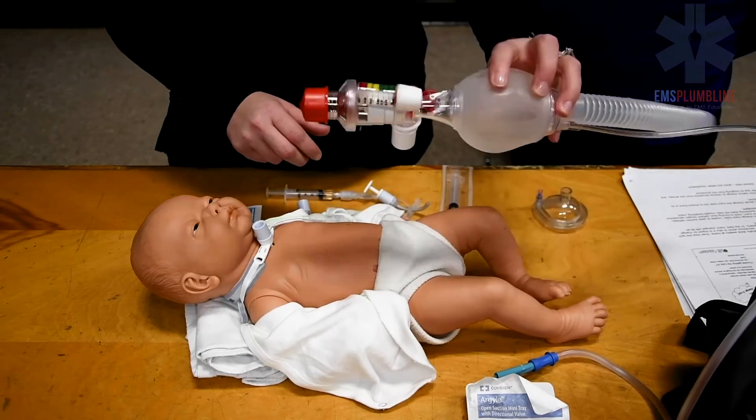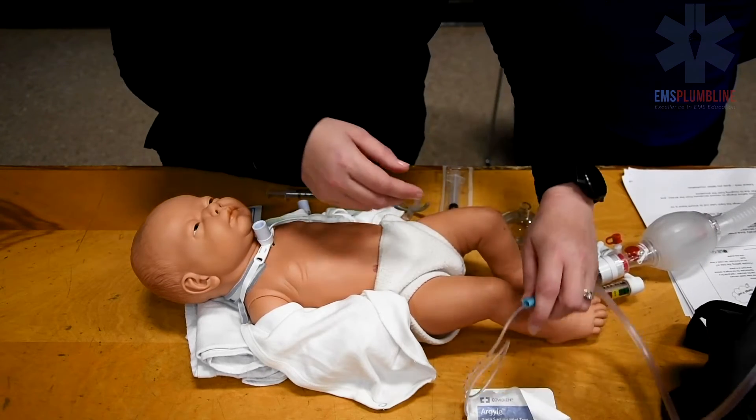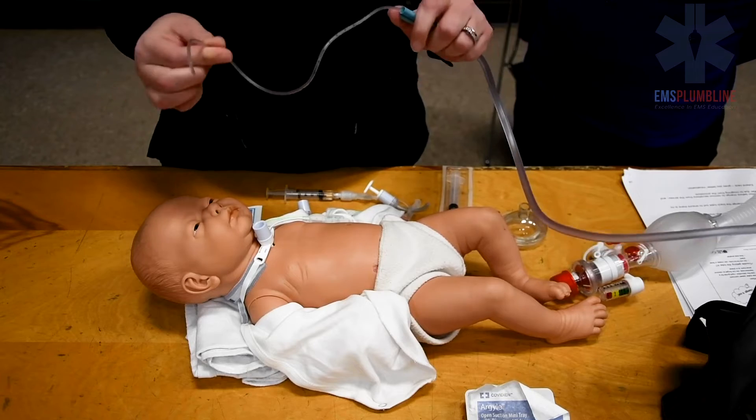Other items to have at the bedside include the resuscitation bag and mask and the suction machine. Suctioning should be performed before and after the trach tube change to clear the airway.